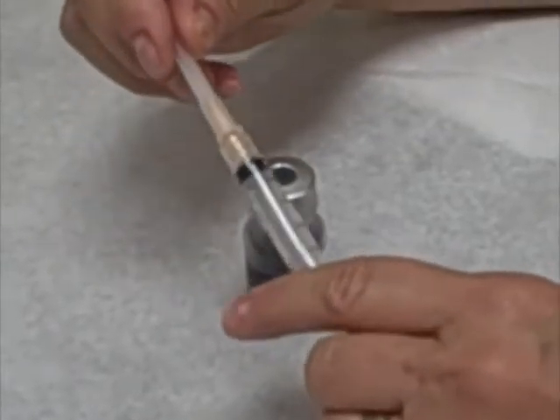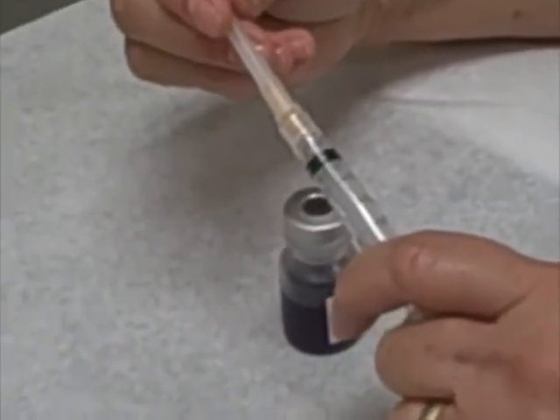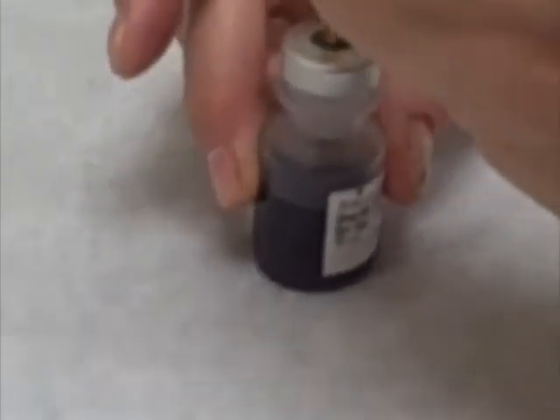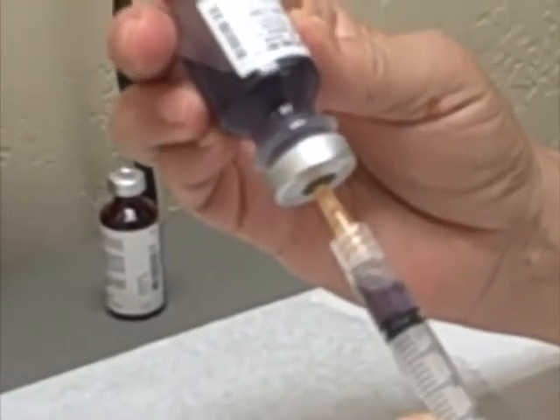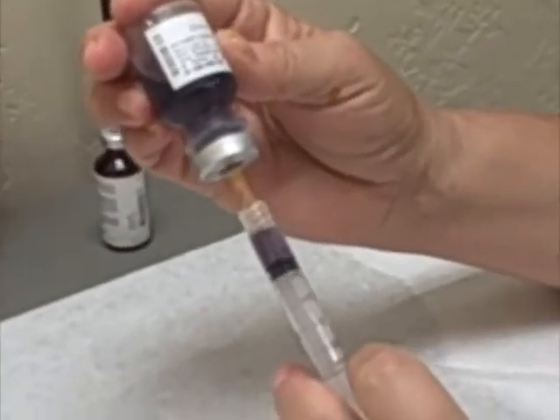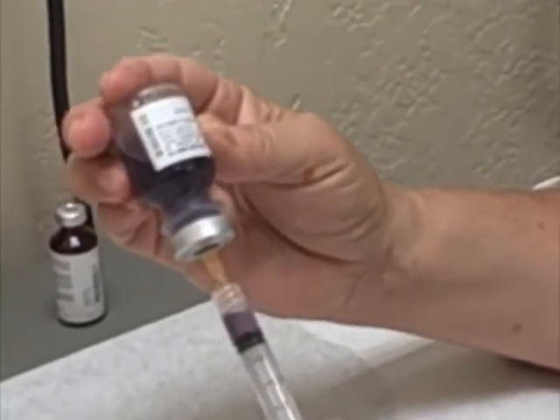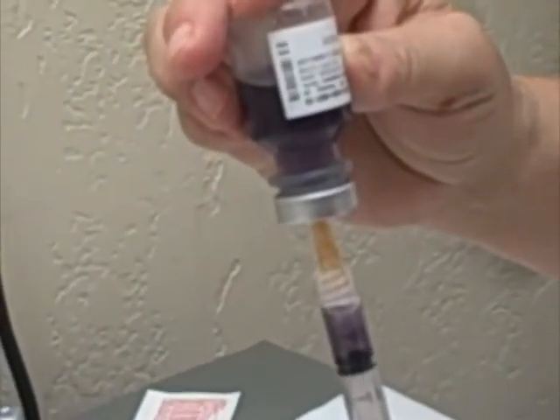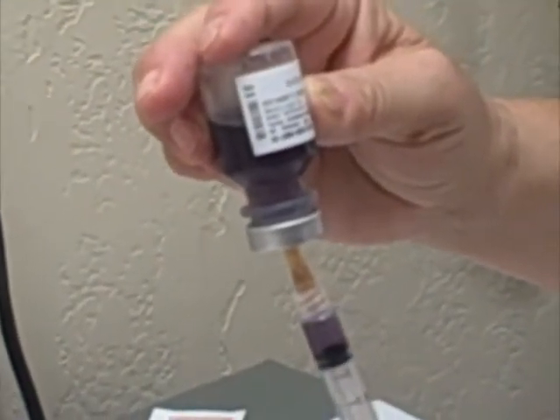I just want to do a quick demonstration to show you one of the techniques we also use. You pull back the amount of air you're going to put into the syringe. You inject the air into the bottle, and then you pull back the medication that you're going to take. And just to let you know, sometimes the syringe will fill okay. Sometimes you need to pull it back to the marking of the actual medication. You also want to flick out any air bubbles.